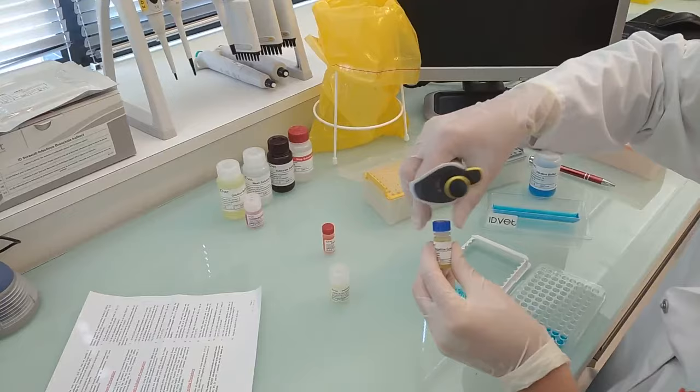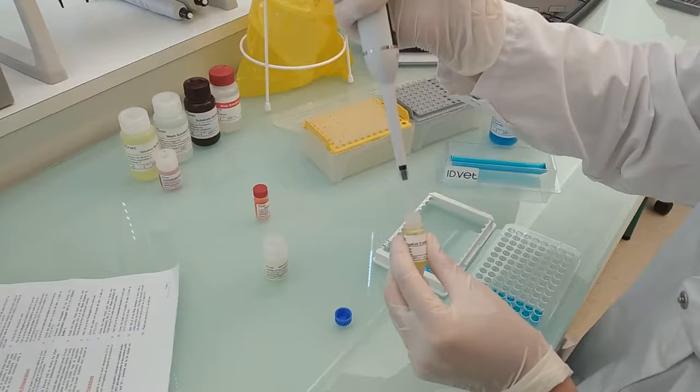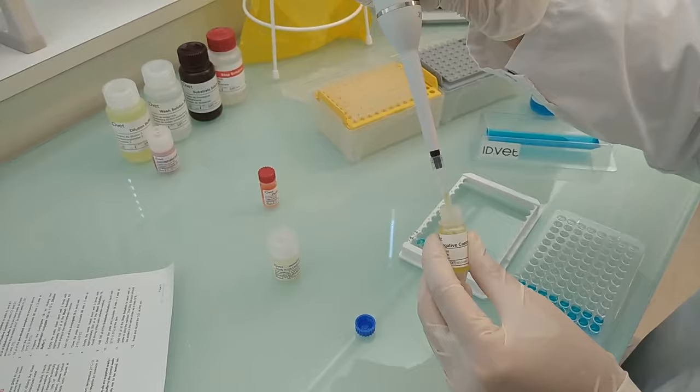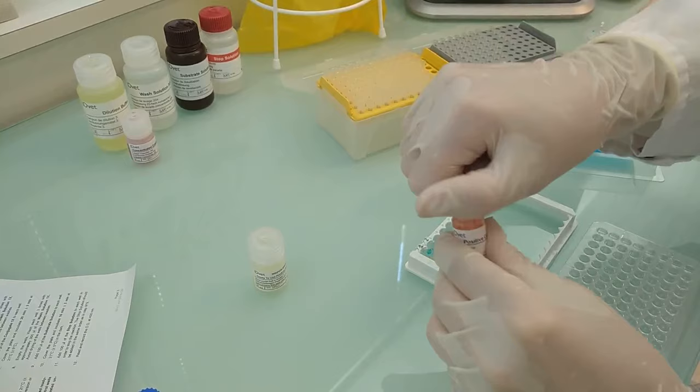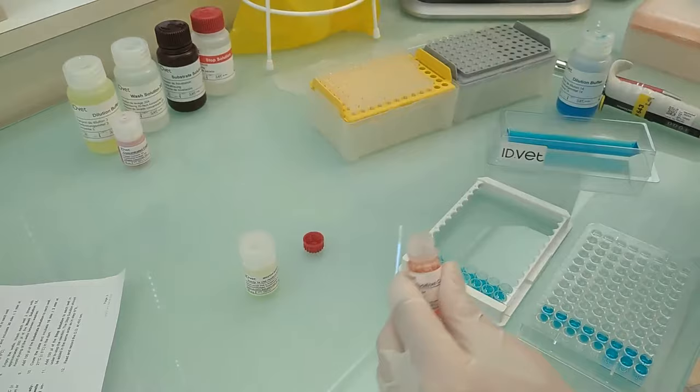You will now add the controls: 100 microliters of the negative control to wells A1 and B1, and 100 microliters of the positive control to wells C1 and D1.